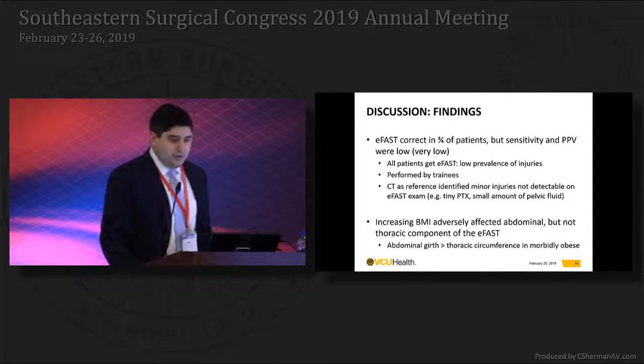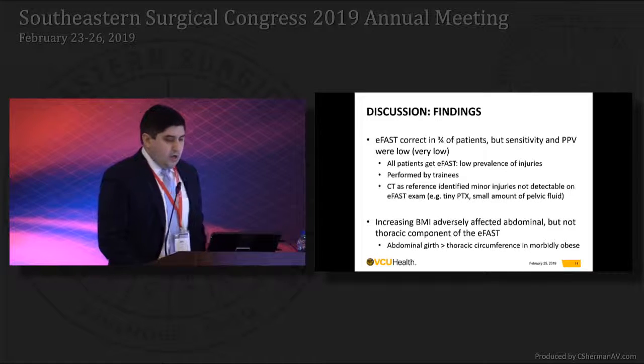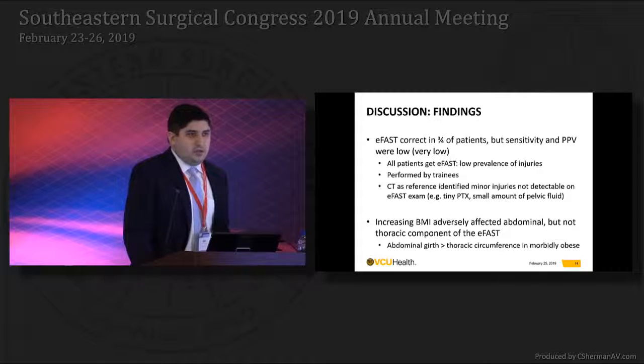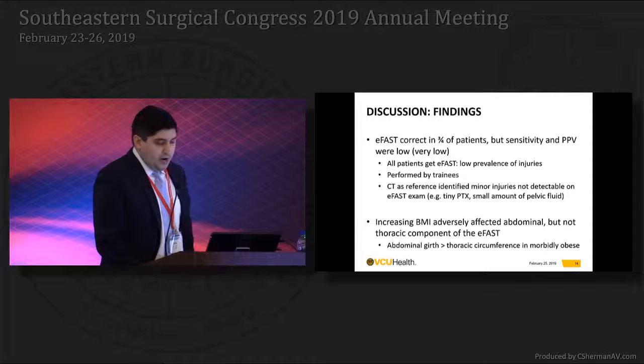So our EFAST was correct in about three-quarters of our patients, but sensitivity and positive predictive value were very low. And this is for a number of reasons. First of all, all patients who come into our trauma bay get EFAST exams. Therefore, this is primarily for training purposes, so there is inherently going to be a low prevalence of injury. Also, the EFAST was performed by trainees.